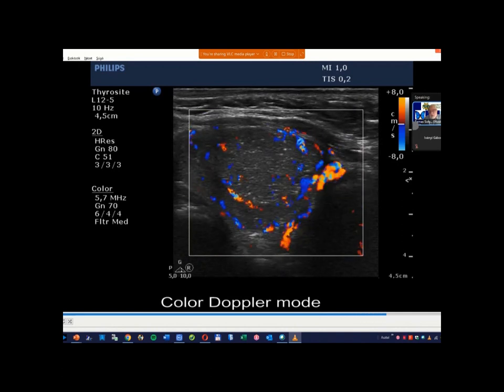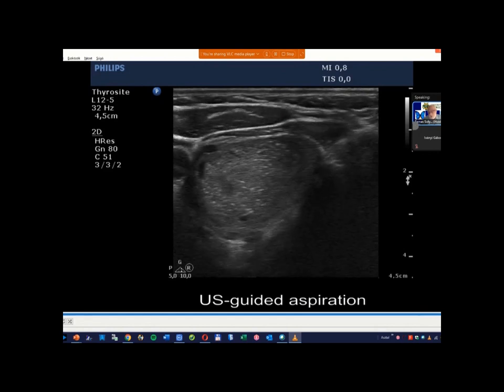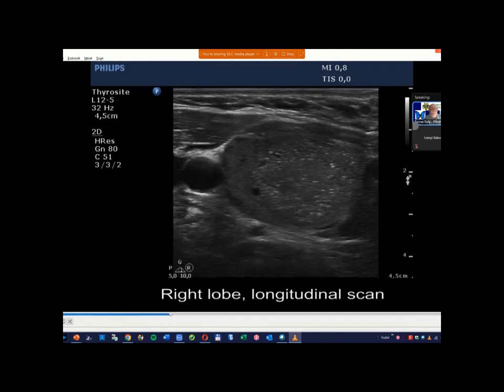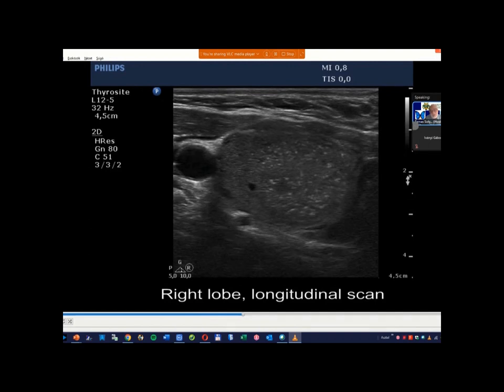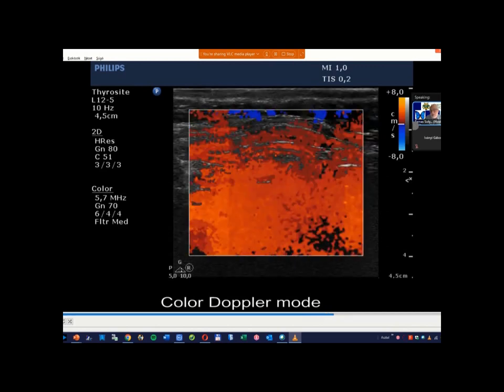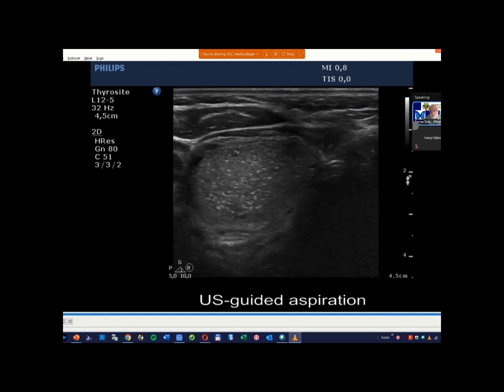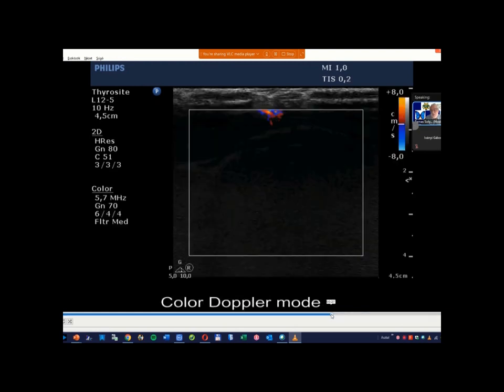Regarding the second question, whether there are unequivocal forms of microcalcifications, 13 colleagues stated that there are unequivocal forms, but 16 were of the other opinion. I warn you, if you meet such a pattern, not to take sides on whether these are clear forms of microcalcifications. Naturally, cytology is clearly indicated, but I cannot exclude the possibility that one or another of these forms is microcalcification, but the entire pattern stands for proliferation of connective tissue or backwall figures. So I can accept if someone raises the possibility that these granules are partly microcalcifications, but these are not obvious forms of microcalcifications.